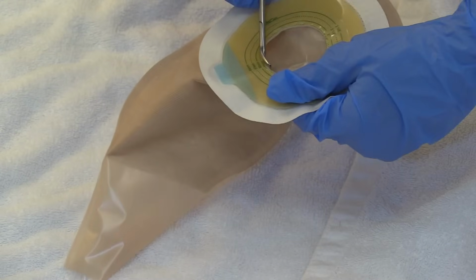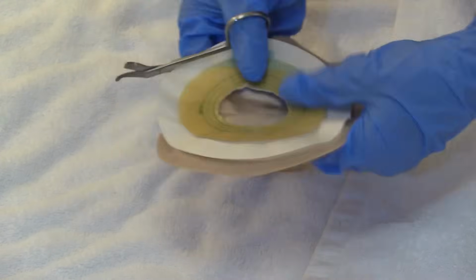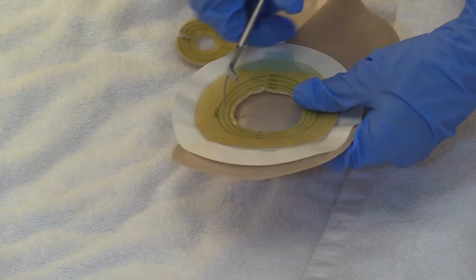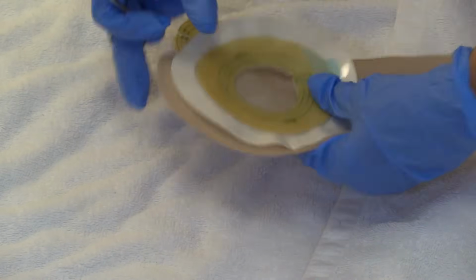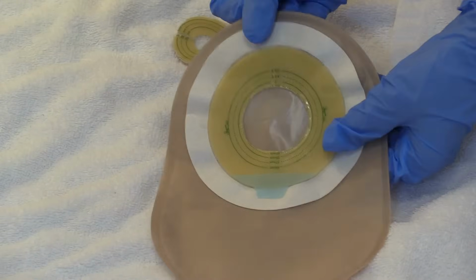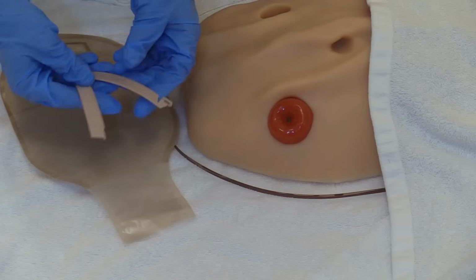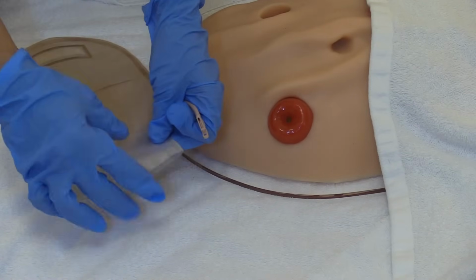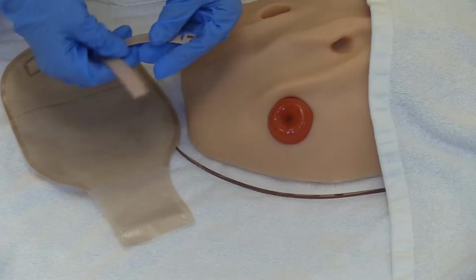And just go back through and make sure everything's nice and round and there's no jagged edges, because you don't want this to wear on the stoma or on the patient's skin. And we have it and it looks good. Now let's put the new pouching system on. What I like to do is I like to snap my bag and make sure it's closed before I put it on, just in case something leaks out.